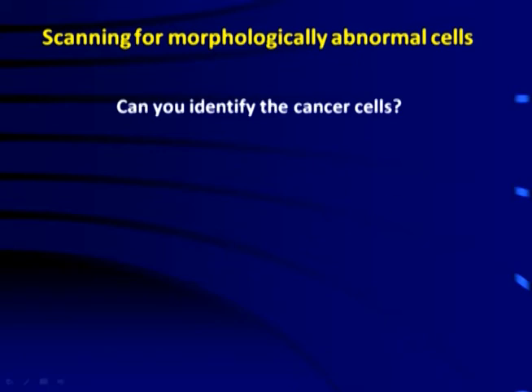Now, we do not do these under the microscope anymore with genetic or FISH technologists. 100% of our UroVisions are done on an automated instrument. They are very, very sophisticated, what we crudely call FISH spot counters. They're called FISH image analysis systems. Their first generation was in late 2001, early 2002, and since then they've evolved.